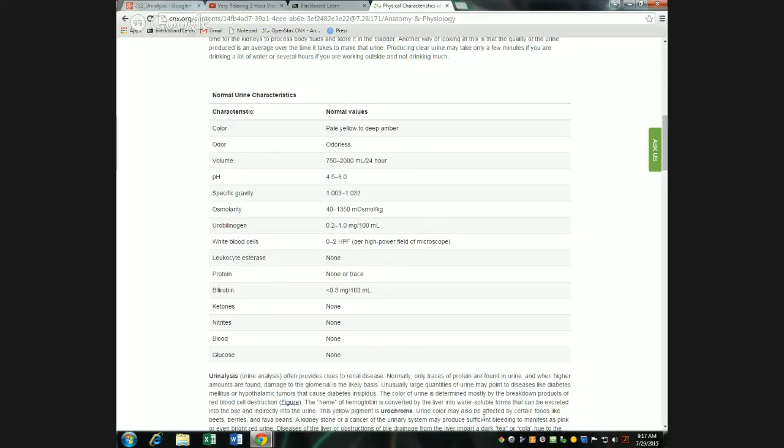Now, every so often we get one of these, and it's usually the urobilinogen one, that comes out some weird color that's not on the bottle. If that's the case, then the test just didn't work. I think that particular test is very sensitive to oxygen, so if it's exposed to the oxygen in the air around us, the color reaction stops working. That usually happens because people leave the lid off of these bottles too much.